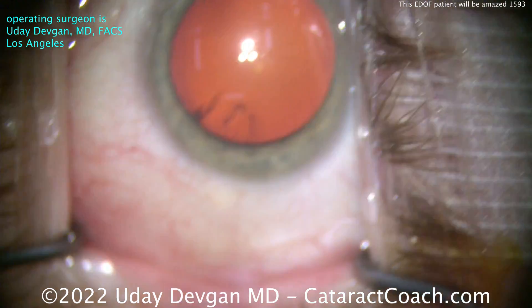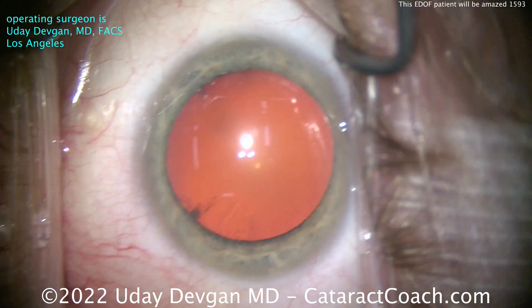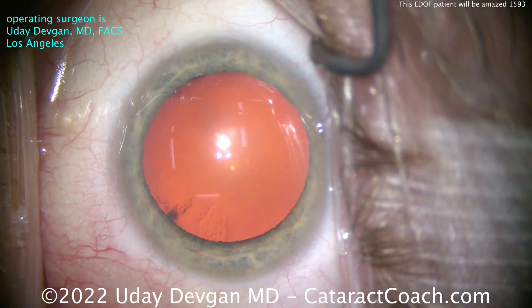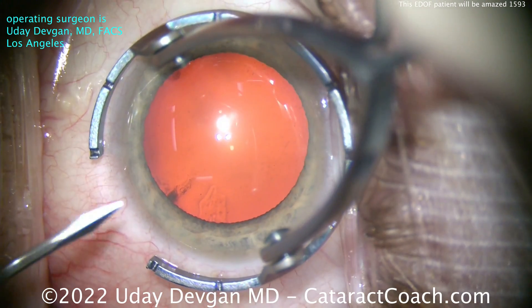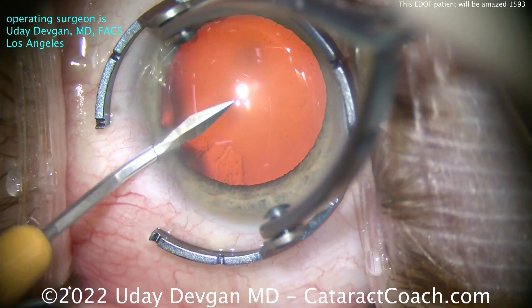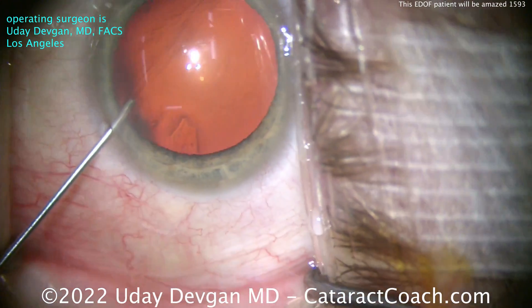The patient is highly myopic, wearing about a minus 10 prescription for distance, and actually prefers to walk around slightly under-corrected in spectacles. The patient is aware that he's going to lose the near benefit of the minus 10.